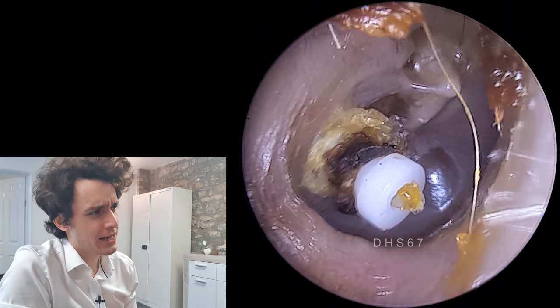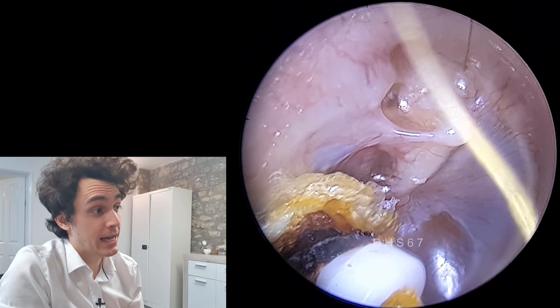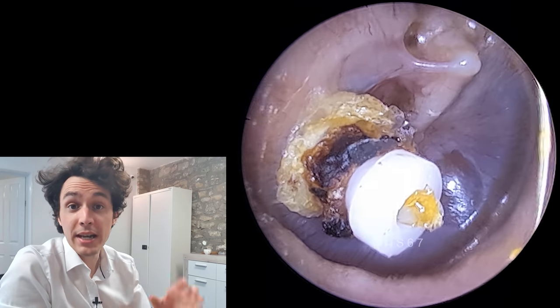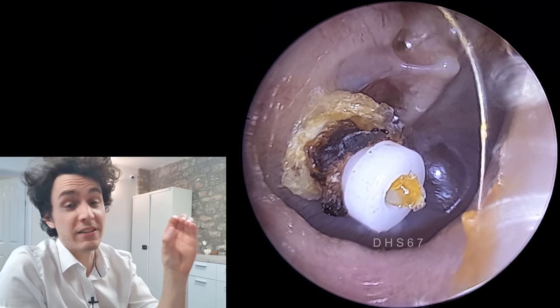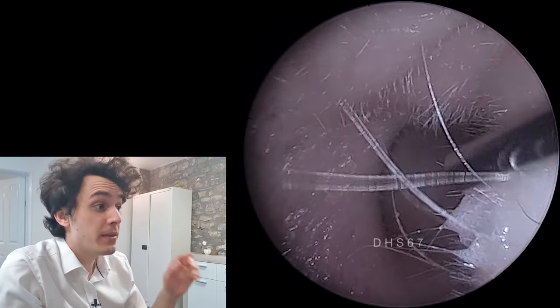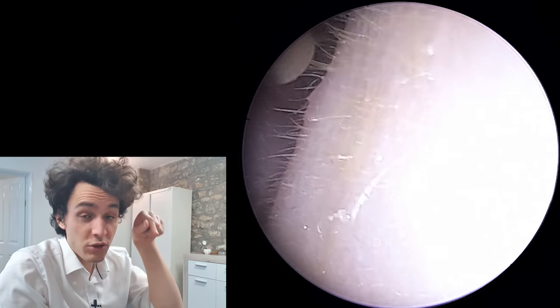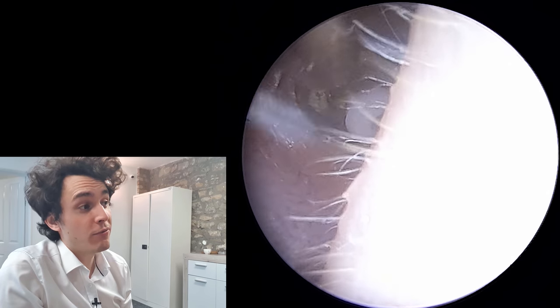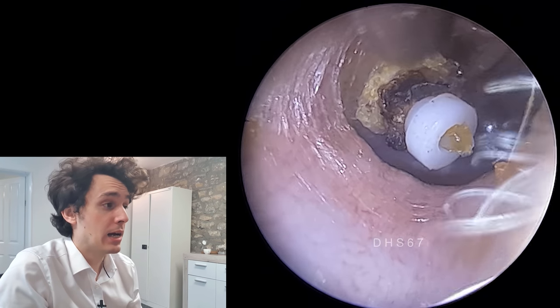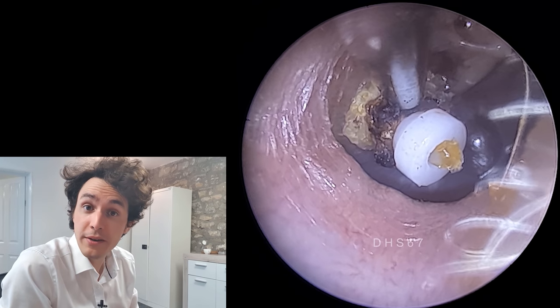We've got a couple of problems with this patient here. First and foremost, you can see that there's a grommet in the ear. A grommet is essentially a cylindrical piece of plastic with a hole in the middle. It will be put in there by a surgeon — the surgeon will actually make a cut in the eardrum and then insert the grommet. That is to allow for middle ear ventilation, and it will be implanted in cases where there is chronic eustachian tube dysfunction.